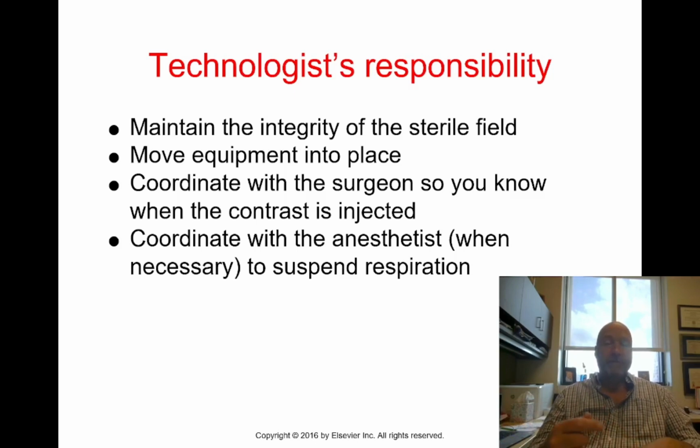And if you are shooting with portables so that you've got limited exposure, just one single shot, then you're going to have to also coordinate with whoever's running the anesthesia, the anesthetist, to turn off the ventilator so that the patient's not breathing during the exposure.